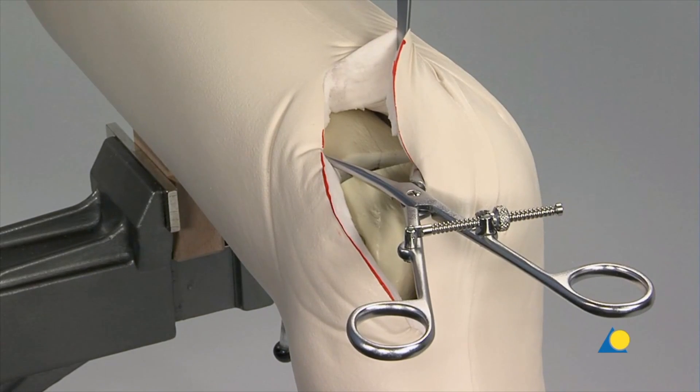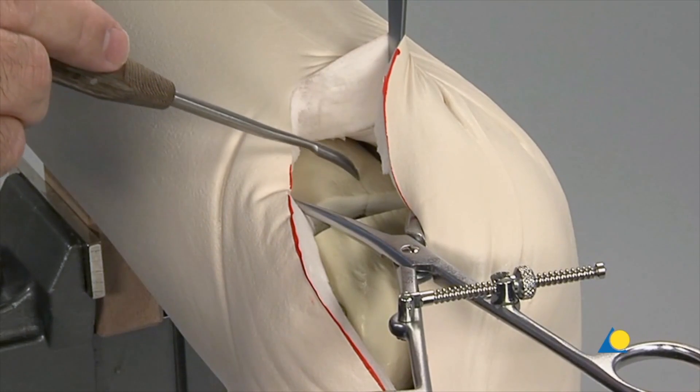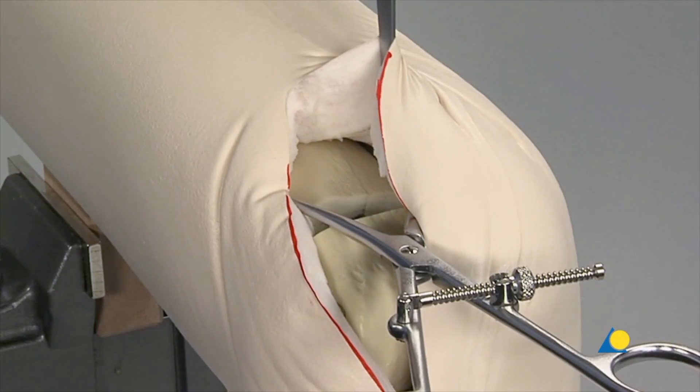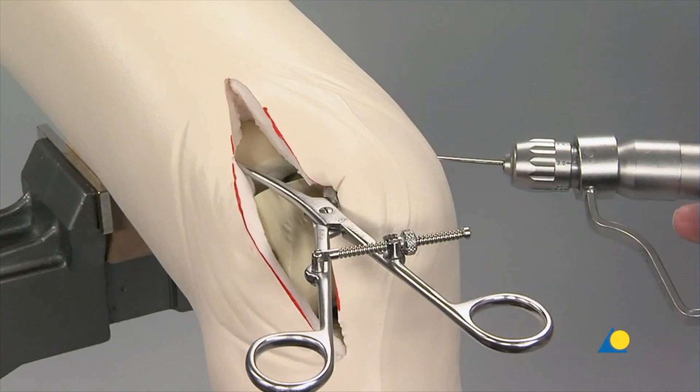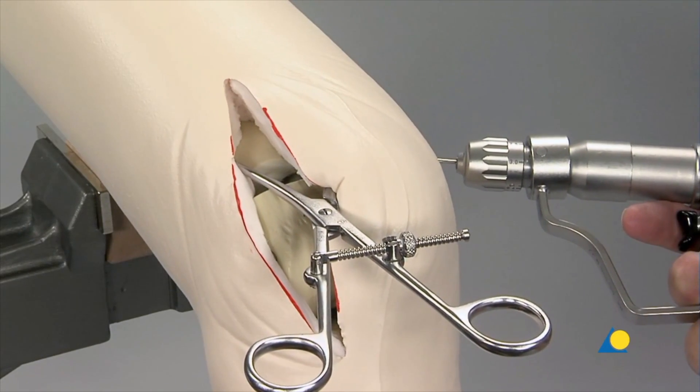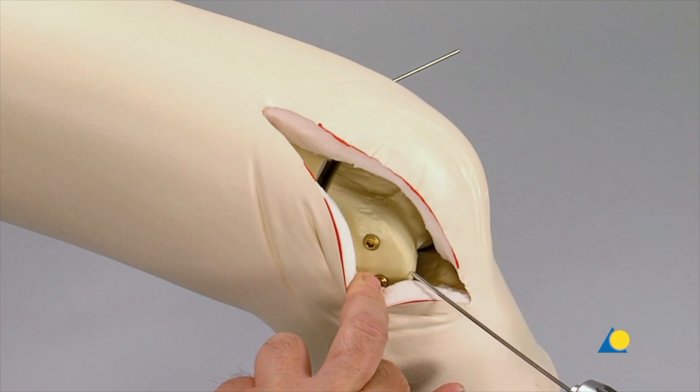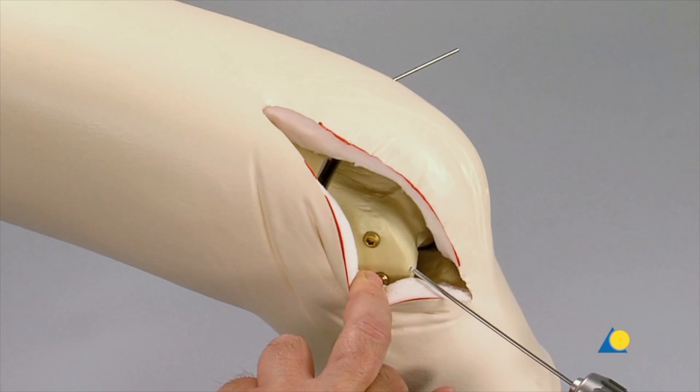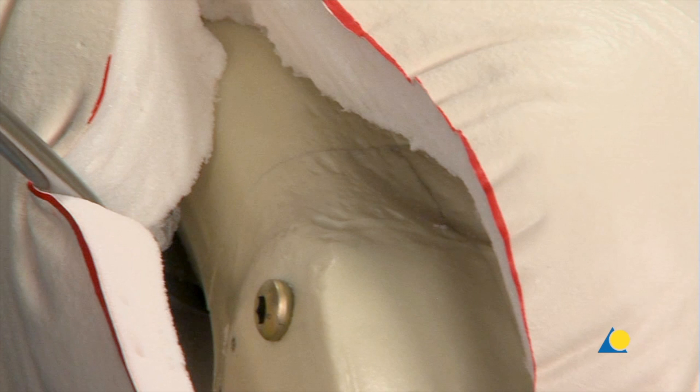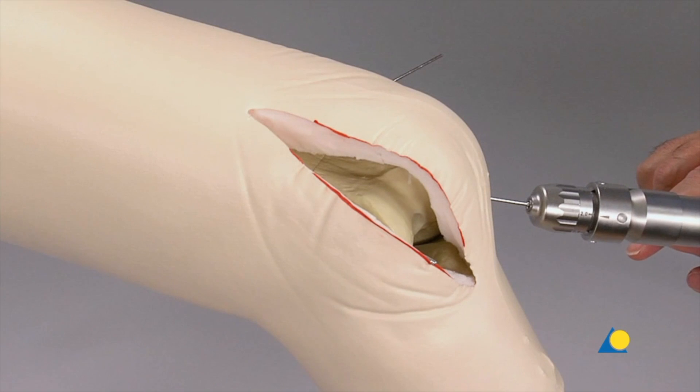The medial fragment is reduced to the shaft using the pointed reduction forceps in order to make a good reduction to the joint block. A K wire is inserted percutaneously to secure the reduction of the medial fragment. The joint block is reduced to the shaft and held in place with a K wire. It is important to have a good reduction before the LCP-DF plate is applied. A second K wire is used to ensure rotational stability.